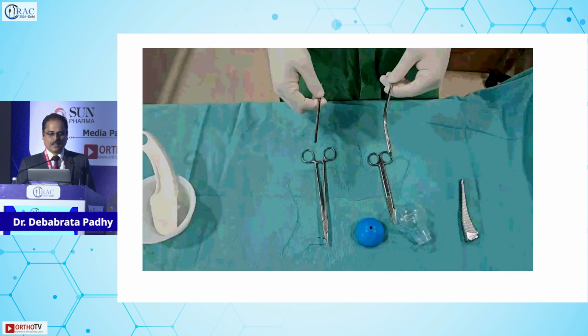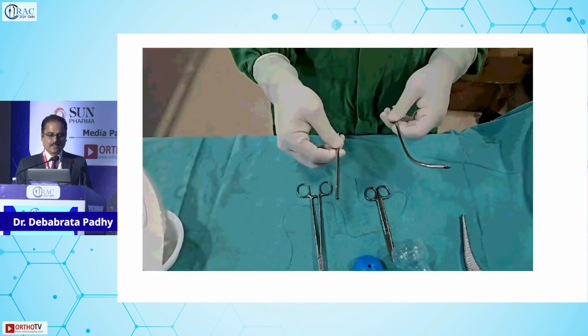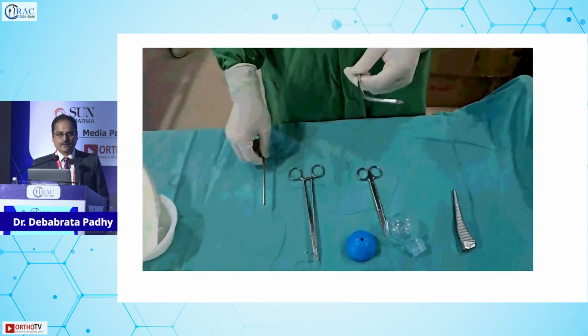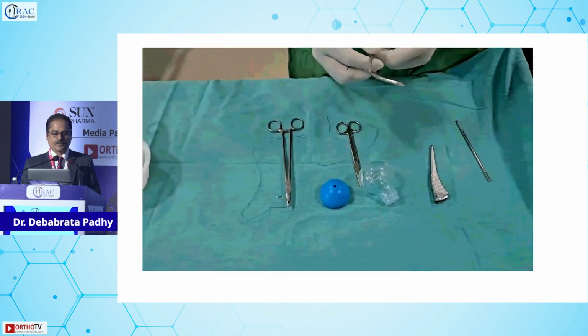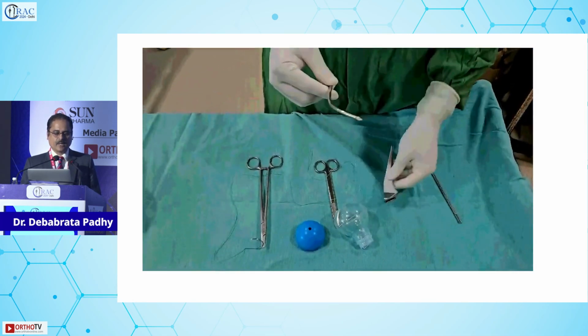This is what I follow, and this has been done by Dr. Javed only, and he is the master of this. So you can see that you can use a Steinman pin and bend it to the angle which you prefer, almost 135 degrees, and make the stem.